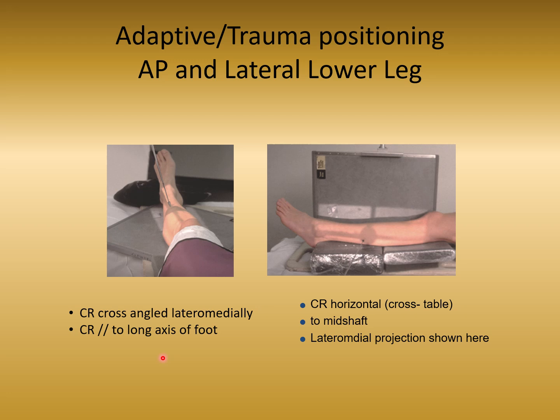I know that you would notice the light field being so low, and that's okay. It's trauma. So that happens with trauma positioning.